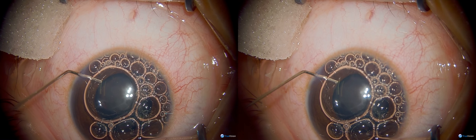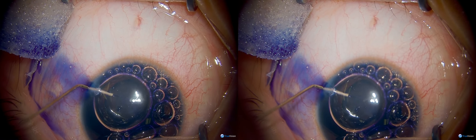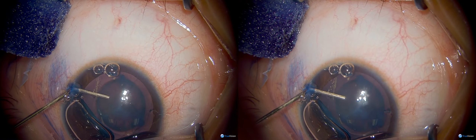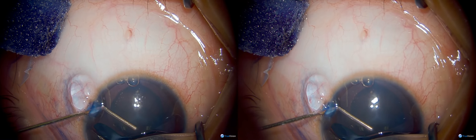Frequently that shadowing leads to difficulty with seeing the capsulotomy, as they are almost equivalent in appearance. Some capsular staining has been done and irrigated from the anterior chamber.